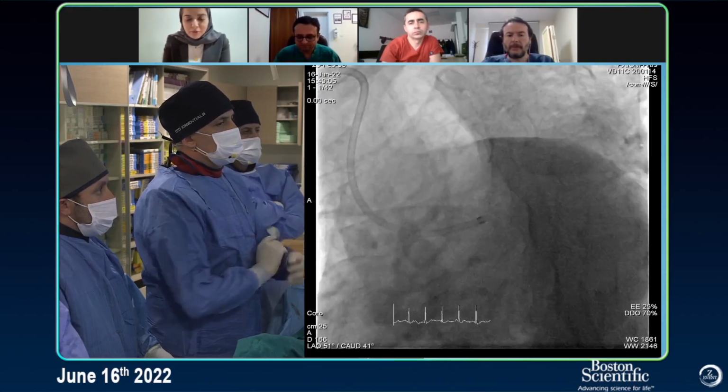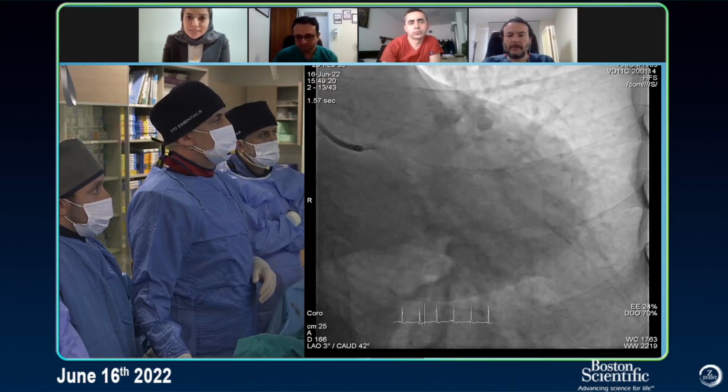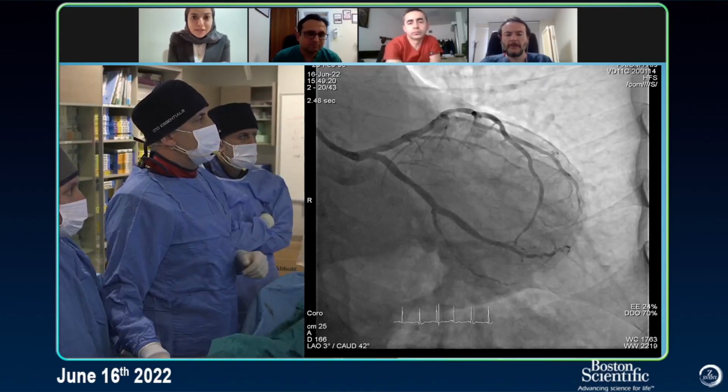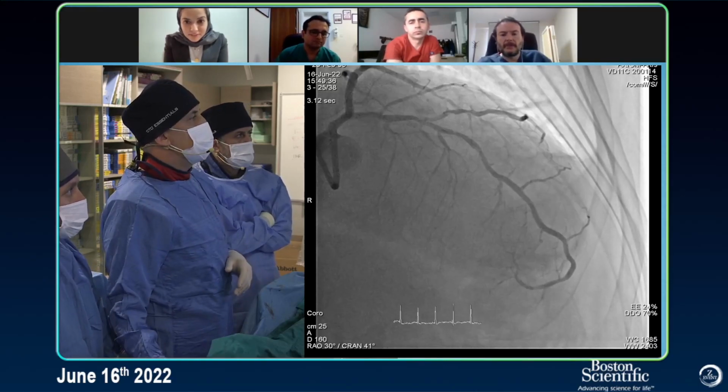Just going through the panelists here. Shafkat, would you just try and see balloons first and see what happens? Let me show you. Yeah, sorry. Let me show the fresh angio, and then you. Yeah, I'd like you to discuss this case, and also maybe I can show you the IVUS first.